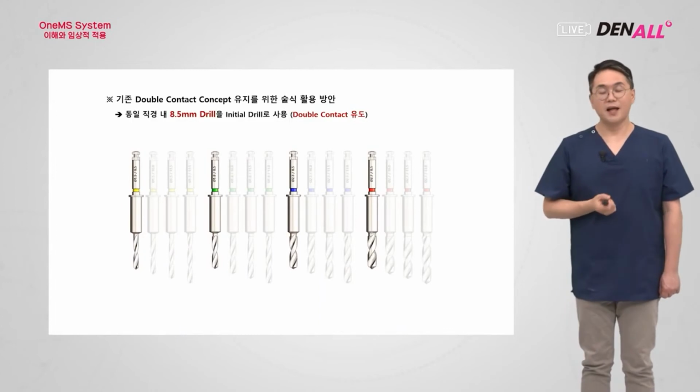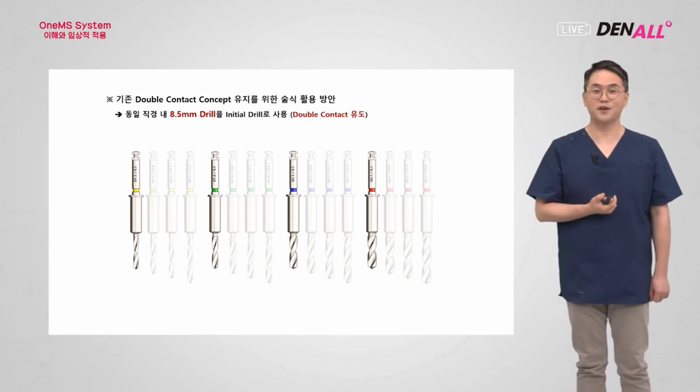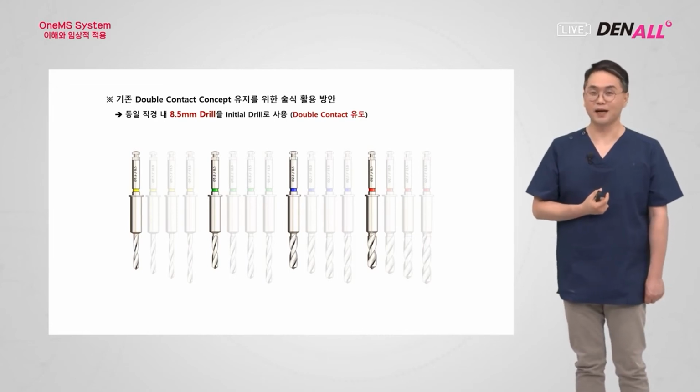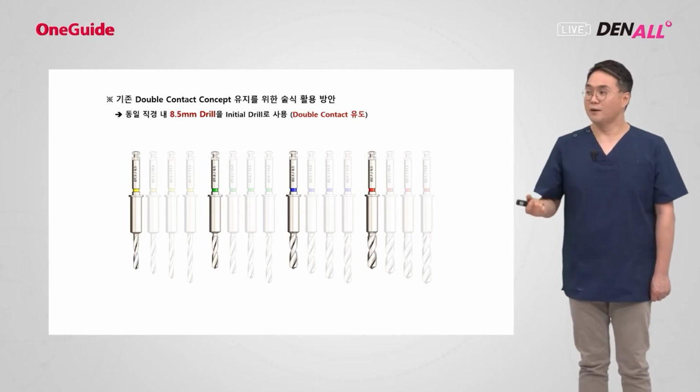Now, how to use it? The MS implant has a sharp apical area. It looks as if it's a bone screw. So you don't have to do full-depth drilling. It sort of self-penetrates, and initial stability is designed to be strong. So based on the surgeon's experience, you drill and place the implant.